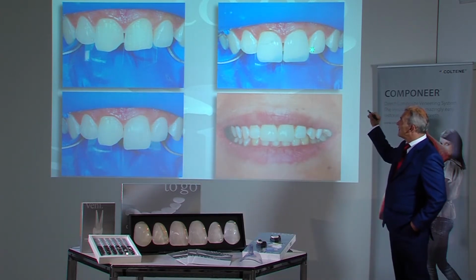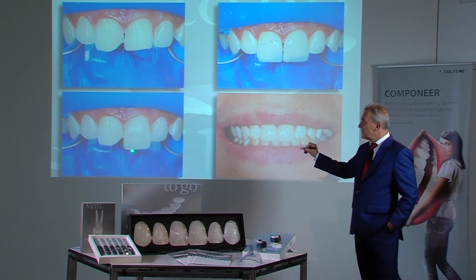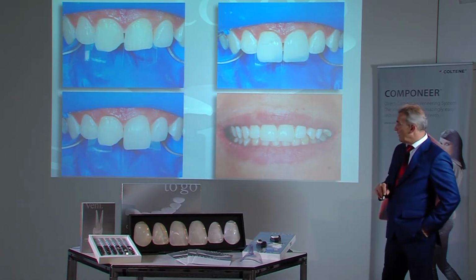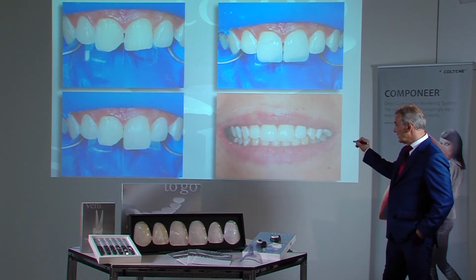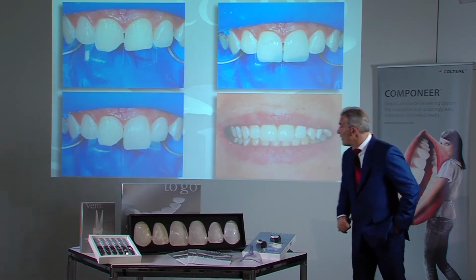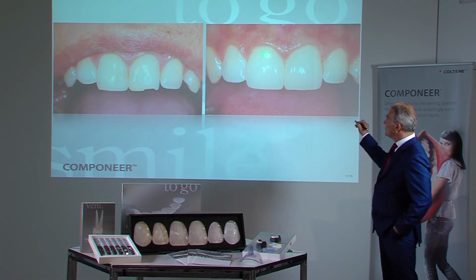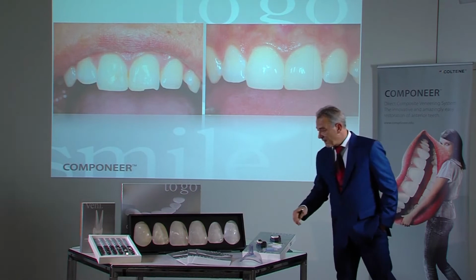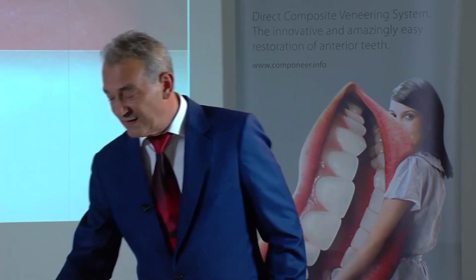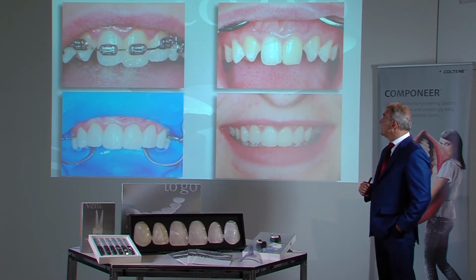One can also see that translucency diminishes with increasing dentine material. This avoids creating a disturbing line. One can also see the shade integration with regard to the adjacent teeth. After a certain period of water absorption, one can hardly distinguish the difference in color. And here too, white opalescence does not make the teeth too white. This depends on which dentine material was used as background.